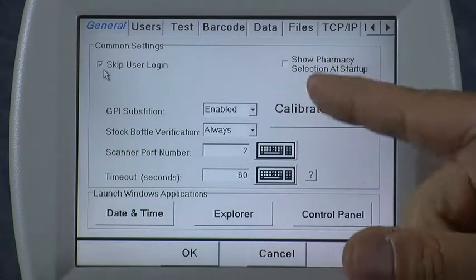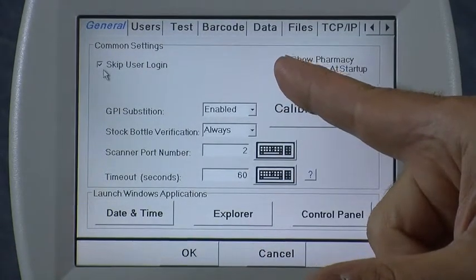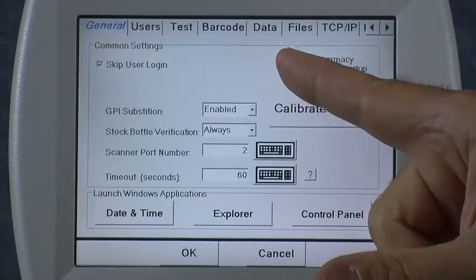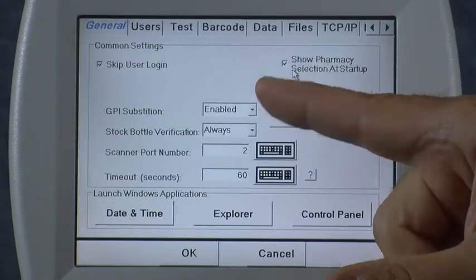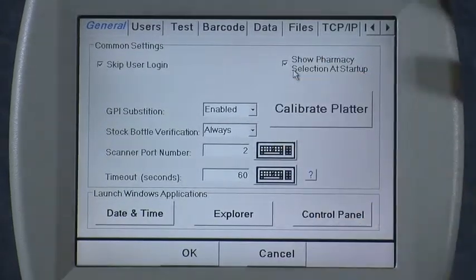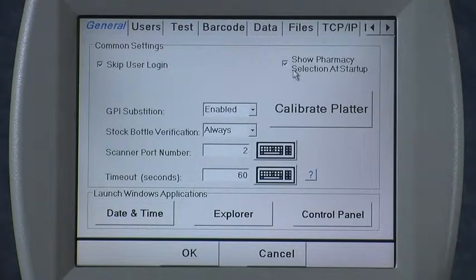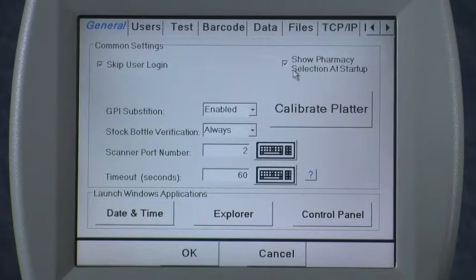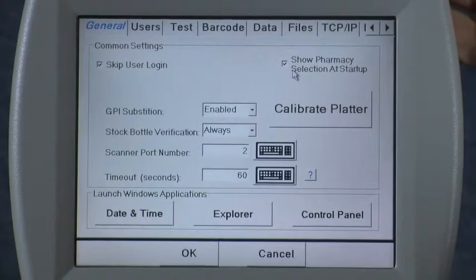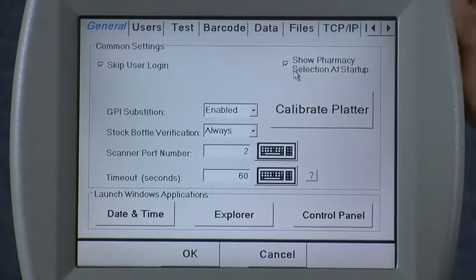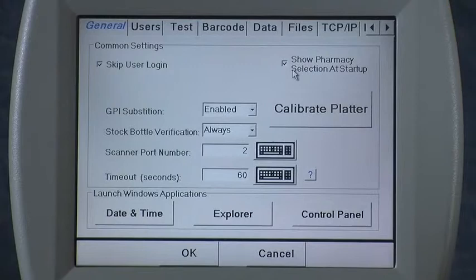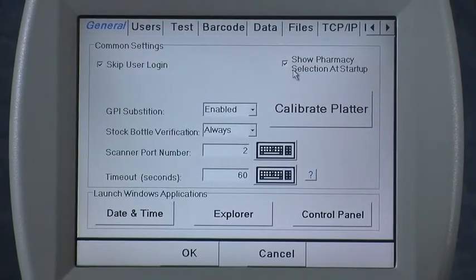The next feature, Show Pharmacy Selection at Startup, is strictly used for people who have had icons for many years and they're using the icon in the old mode of operation known as the PMSS mode.